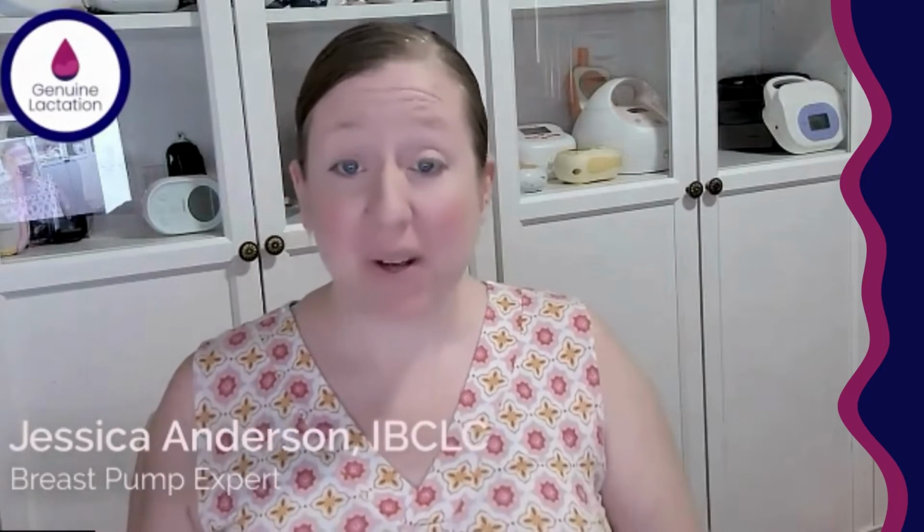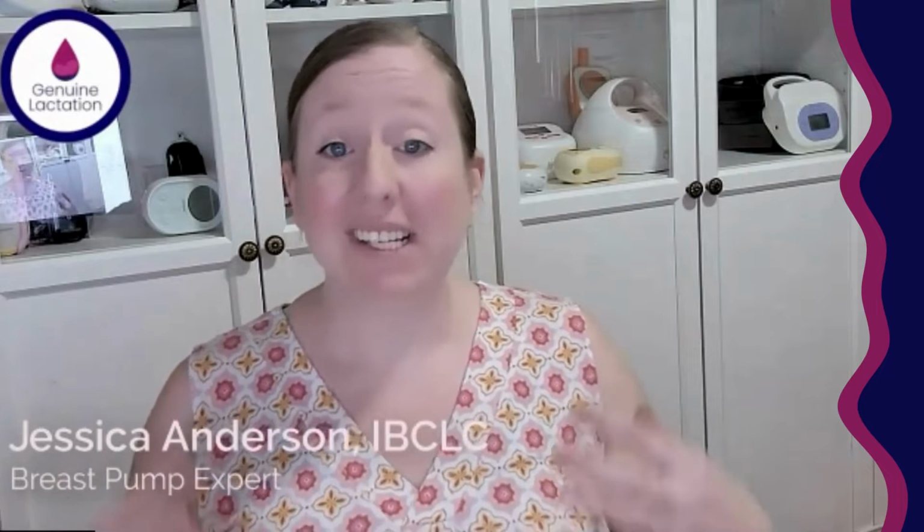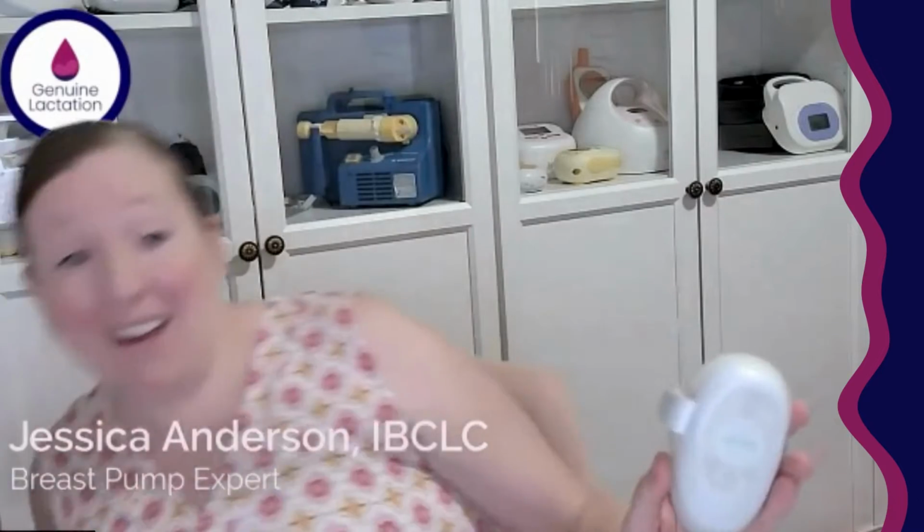Today, we're going to be talking about a really popular portable pump. Yesterday we were talking about the Willow 3.0 and 360, which is a wearable pump, which we tend to mean fully self-contained in the bra. When we're talking about portables, what we're talking about is pump motors that have been designed to be very, very small. So, this is what a heavy duty breast pump looks like.